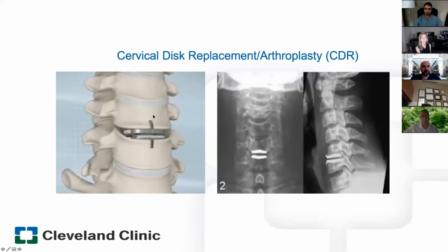So cervical disc replacement arthroplasty, CDR, or total disc replacement, TDR, these are all different terminologies for the exact same surgery. This is not a new technology. I kind of want to stress that. This has been around for a very, very long time. And despite that, there has been a relatively slow adoption, in particular in academic spine, not so much in private spine. And we'll talk a little bit about that for surgeons to use this technology.